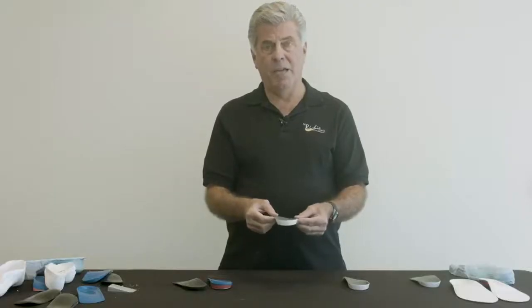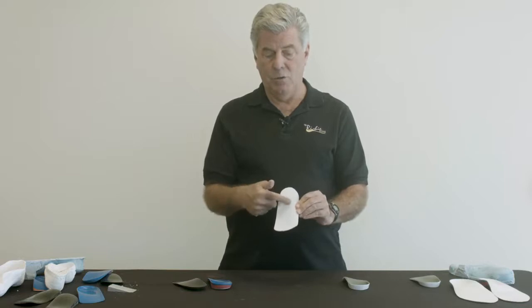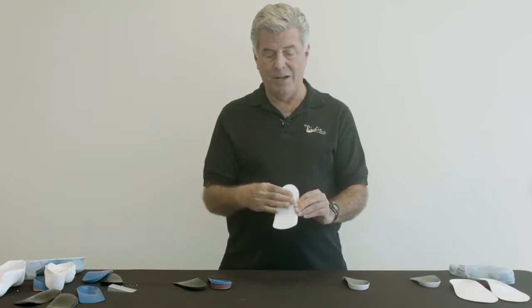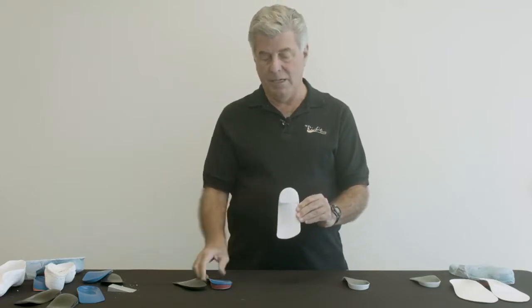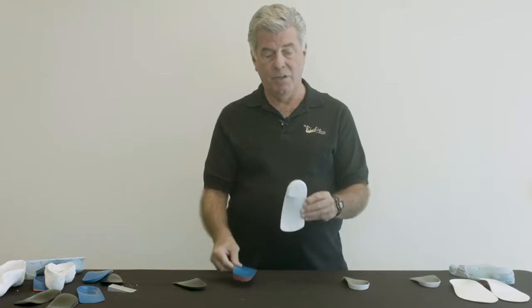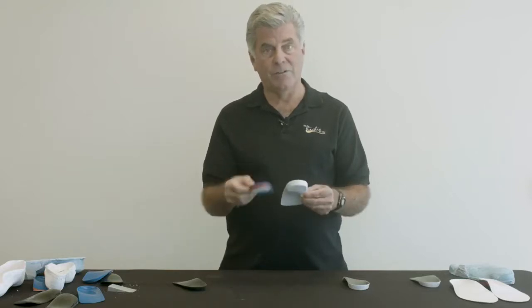This product made by KLM Labs is called the ETEC RX. It is a single shell with an intrinsic post that is part of the original shell and simply ground into the overall device. In doing so, it eliminates the extra step of adding an extrinsic rear foot post. And besides the other advantages mentioned, it's less expensive because it eliminates this extra step.